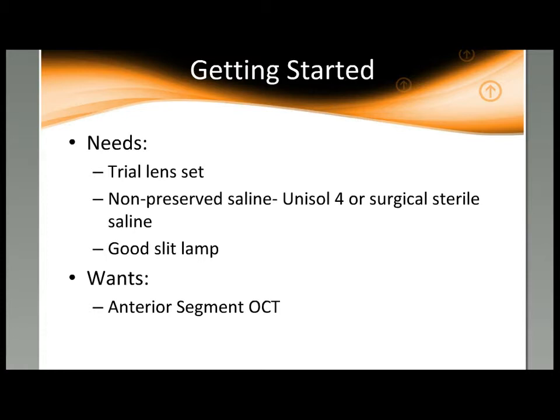Muriel Shornack is a collaborator of mine, and she published the first paper that stated that corneal topography really cannot be used effectively to predict a scleral lens base curve. And this finding was confirmed in an OVS paper my group published last year.